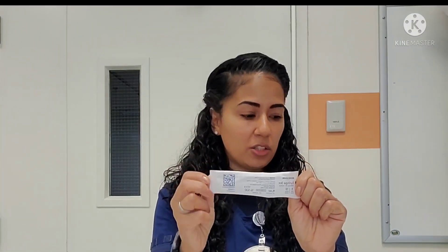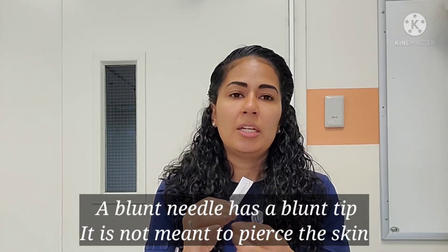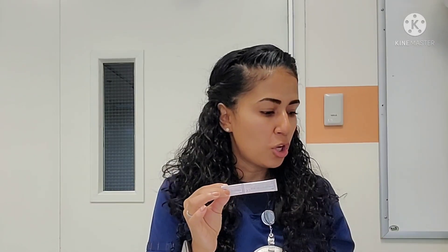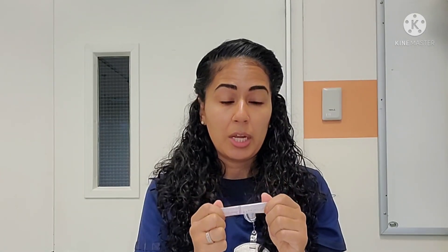The first thing I'm going to do is gather the supplies I need to administer the medication. For today I have a 3cc syringe and a blunt needle. A blunt needle is a needle we use to withdraw medication from a vial — we do not use this to inject into a patient; it's very thick in diameter, it's an 18 gauge needle. The unique thing about this blunt needle is that it has a filter in it. One of my students mentioned that all the videos she has seen use a filter straw and she doesn't have one in her facility. So you can use a filter straw when withdrawing from an ampule, or you can use a blunt needle with a filter.